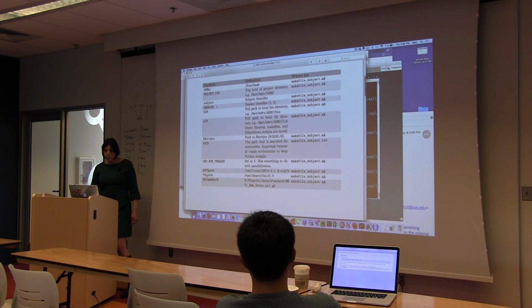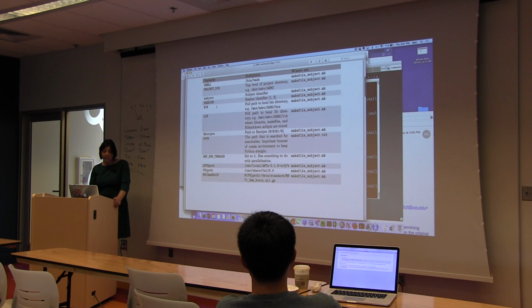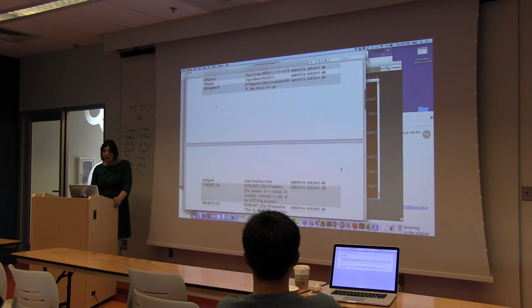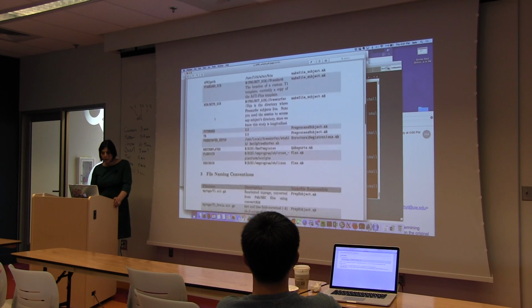So this is really super helpful. It tells you what path you're working with. For example, path will tell us, if we know our architecture, we know what versions of the files we're working with, what programs. ANTs, for example, we know that's Advanced Normalization Tools, and we like that for registration, but there's a bunch of different versions that people are using. I've made this mistake before, 2 different standard brains, 1mm and 2mm, with both standard in the names, so that kind of helps a bit.